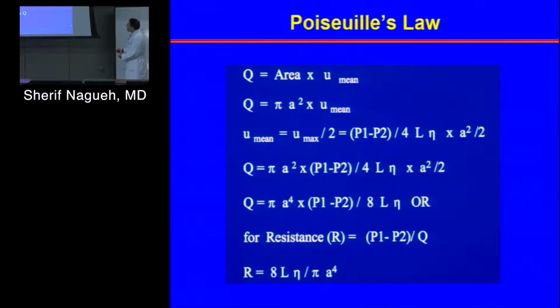We ended up with velocity on the last slide. This takes you from velocity, which is the mean velocity, to flow. For those of you who know some statistics, if you look at the mean value for numbers that are increasing in a sort of same increment, you can get to the mean value by getting the lowest and the highest, and you divide them by 2. So we are interested in the mean velocity, and that's what we see.